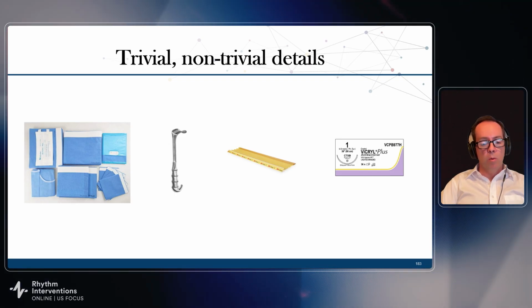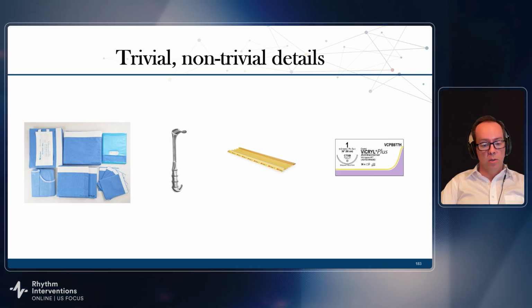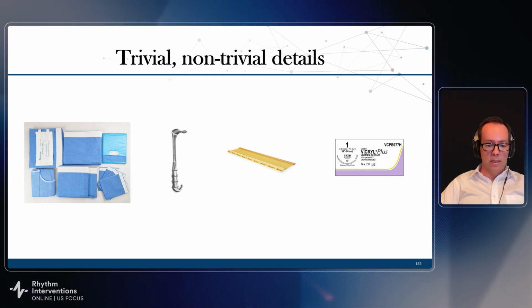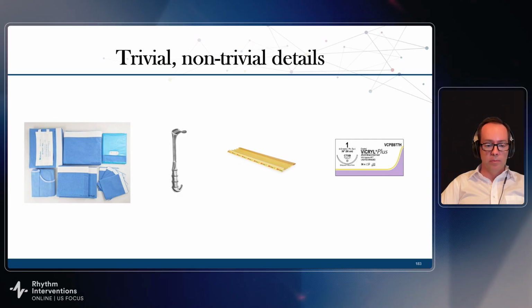Keeping the field quite wide and rolling the patient either by a rolled towel or blood pressure cuff, which I saw yesterday and thought was a very good trick, to inflate and roll that patient on the side to get the posterior approach and get that pocket intramuscular.